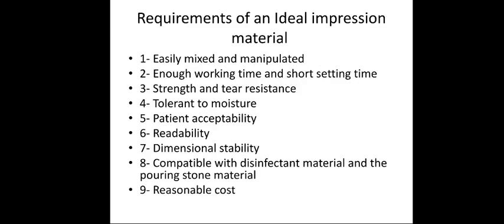The impression should be easily sterilized, should have sufficient working time, should have dimensional stability in order to reproduce the dimensions and the relation between the teeth and adjacent structures carefully. It should have a tear resistance, that it will not be torn when we get it out from the undercut area and from the oral structures.